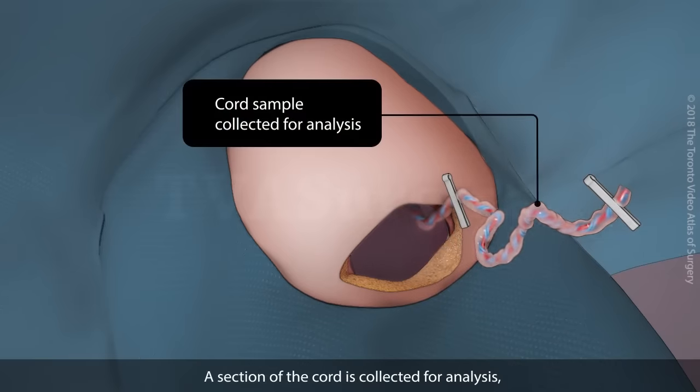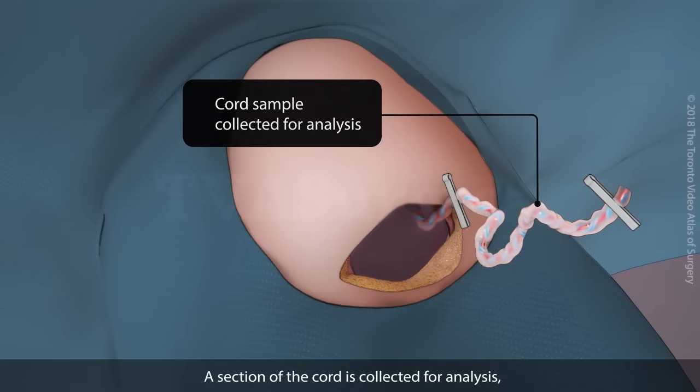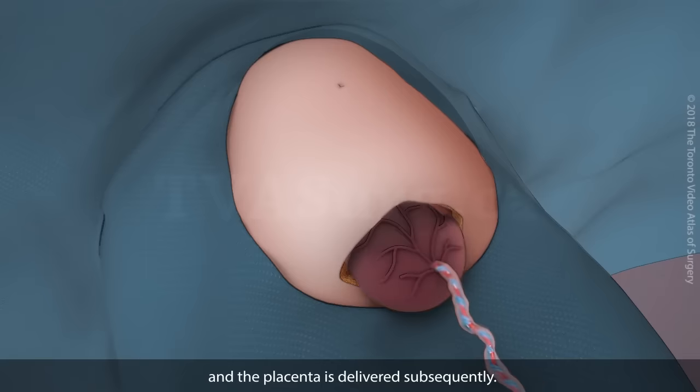A section of the cord is collected for analysis, and the placenta is delivered subsequently.